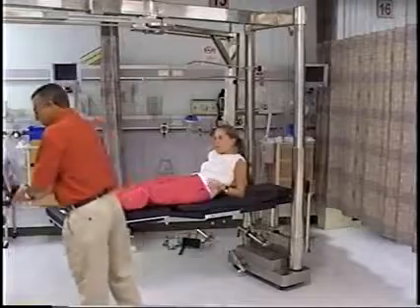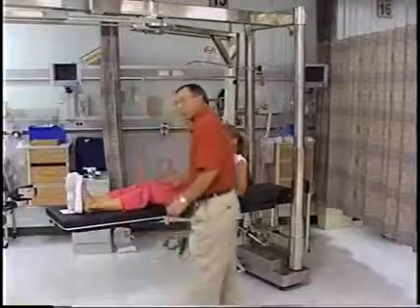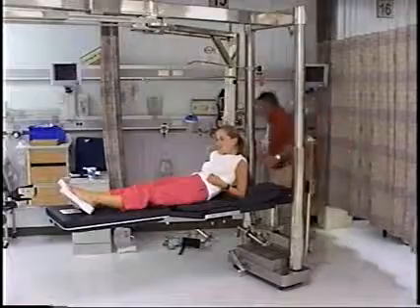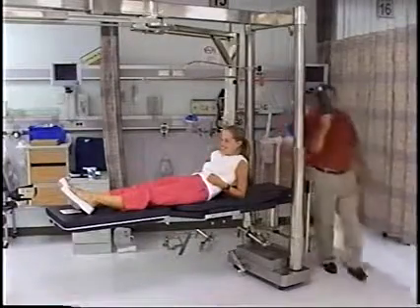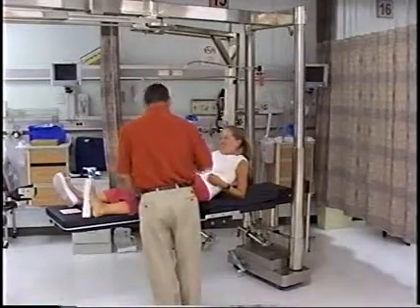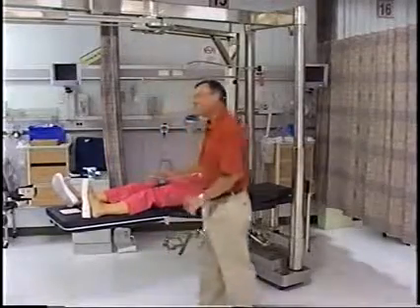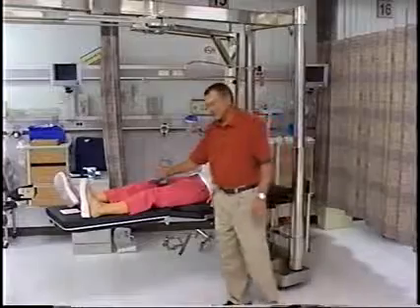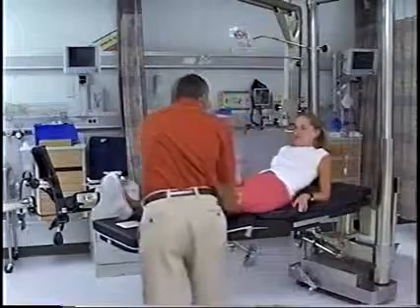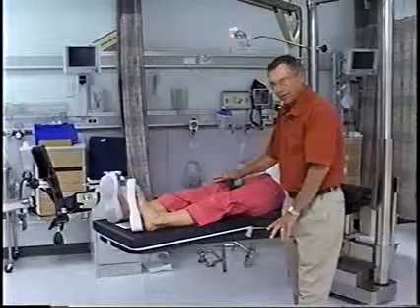So now we're supporting the well leg. We've got a traction device set up. Now, the other thing we have to have is counter traction. This perineal post is going to be dropped. I'm a grandfather, honey, it's okay. It's going to be dropped. You paid extra for this. The counter traction is going to be dropped right at the perineal edge, and she's going to be pulled all the way down right against that post, right against the post.